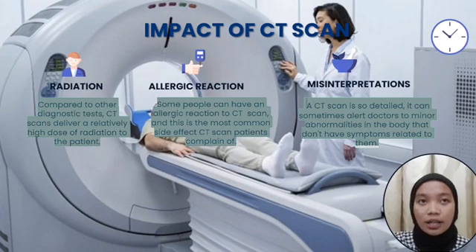Second one is allergic reaction. Patients who undergo a CT scan often receive a dose of what's known as a contrast material containing iodine. This allows specific areas of the body to be highlighted on the scan.